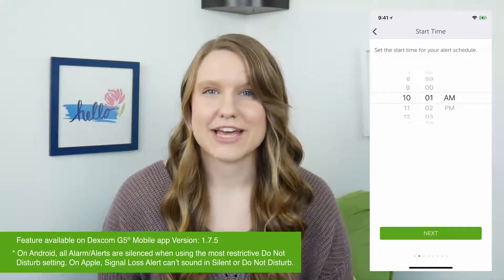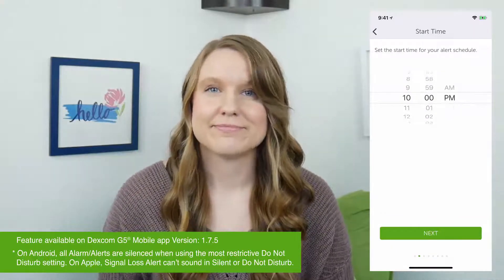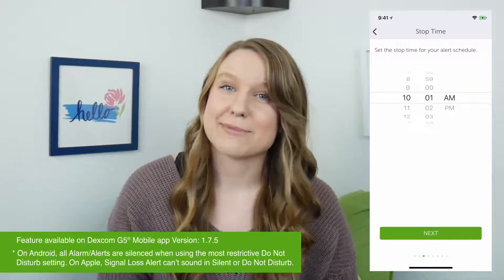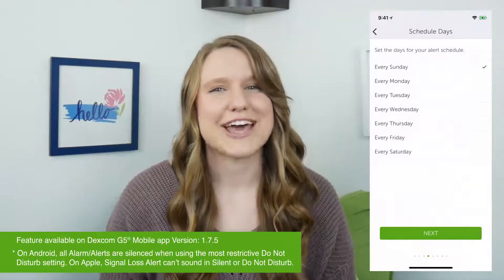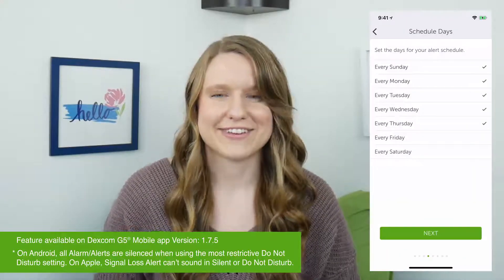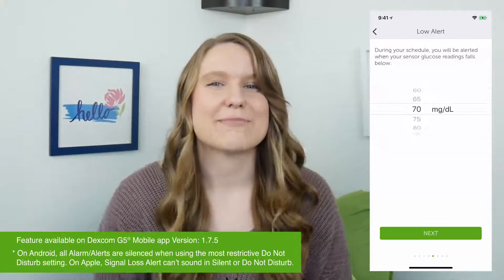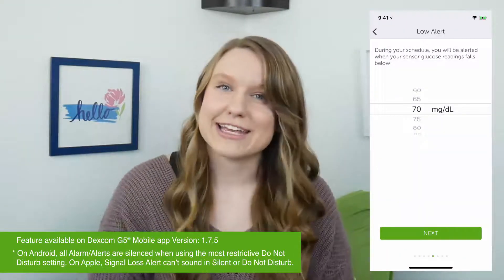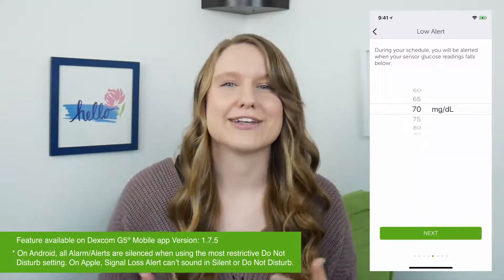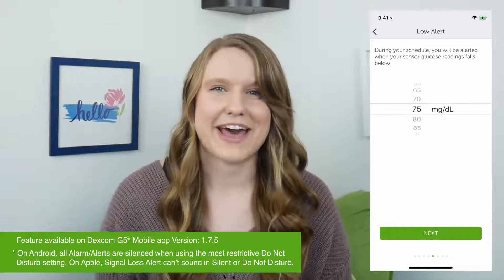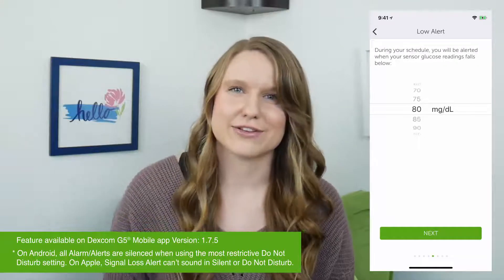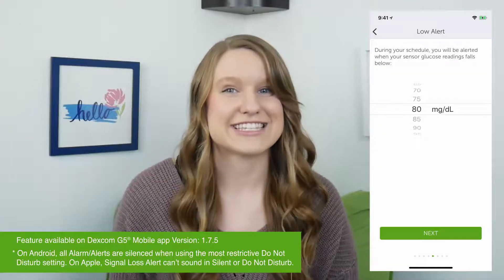I picked a start time of 10 p.m., a stop time of 6 a.m., and chose every day of the week. I set my low alert to 80, because I like my low alert at night to be a little bit higher than my regular low alert, which is at 70.